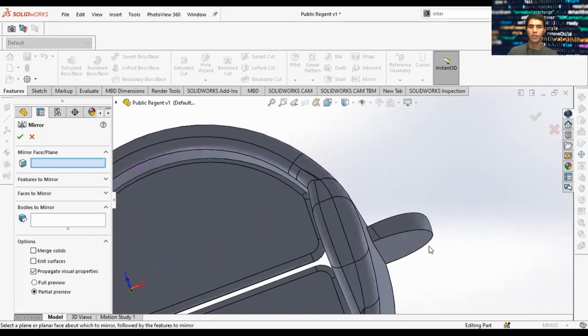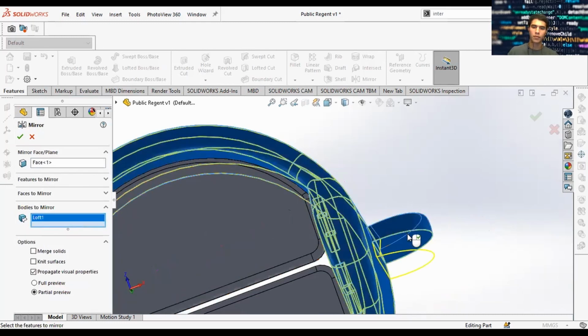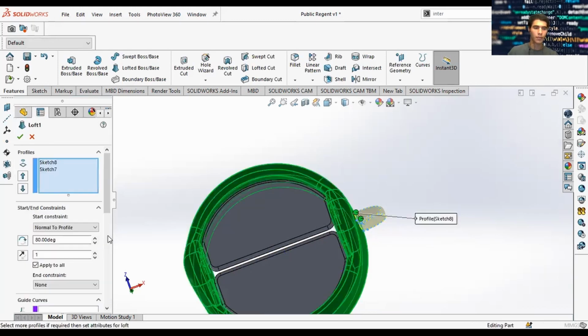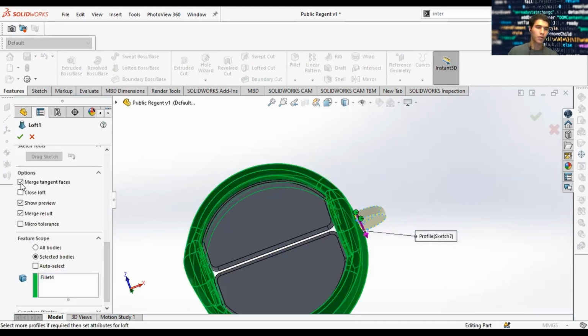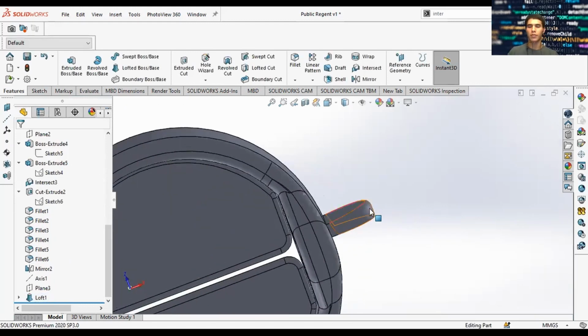Let's mirror now this loft. We'll mirror the loft. Uncheck merge tangent faces. And we'll mirror this loft to the other side.